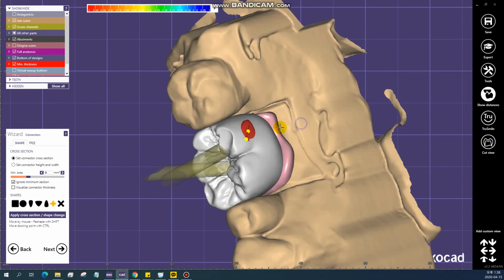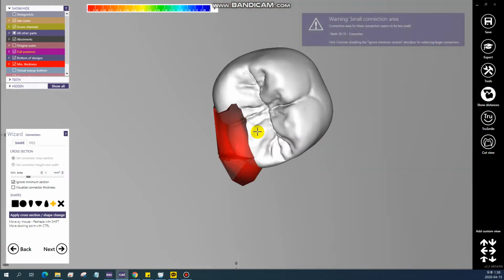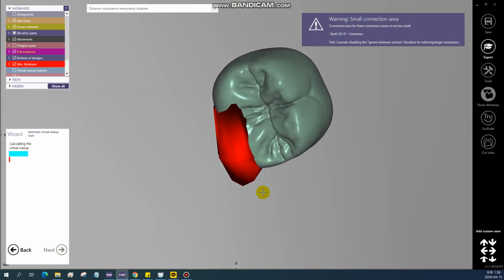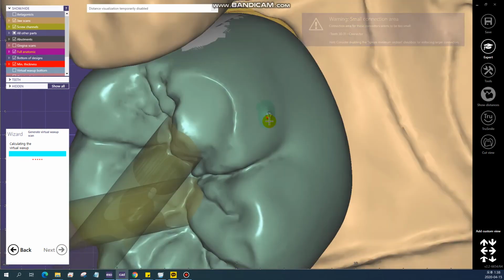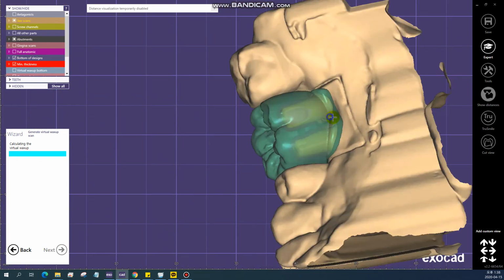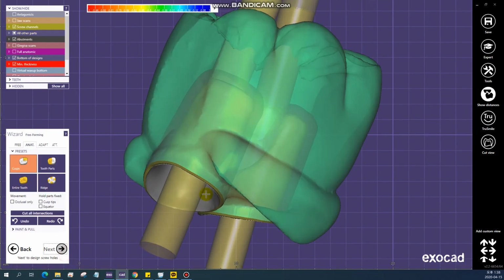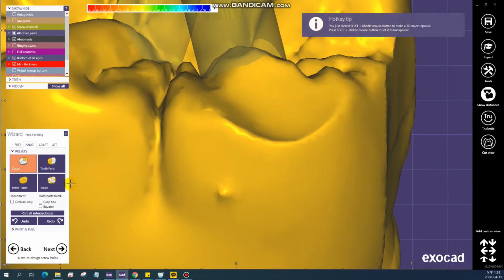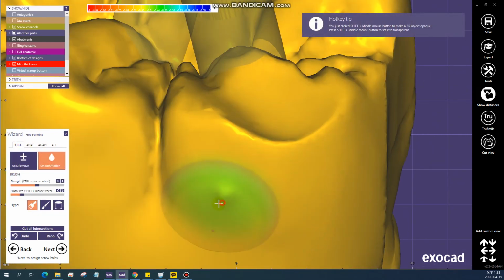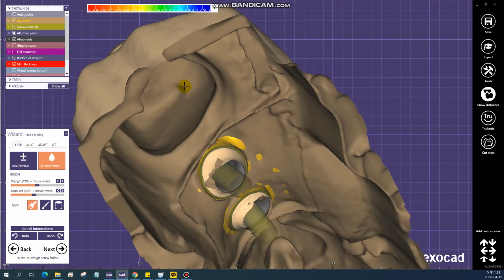And here's the thing that I make as contact with two crowns. Look at the small tiny part attached on the lingual side, and now you can see them merging with each other, and merging with the margins and everything. And look at that small part, now you can see the merging is perfectly well.